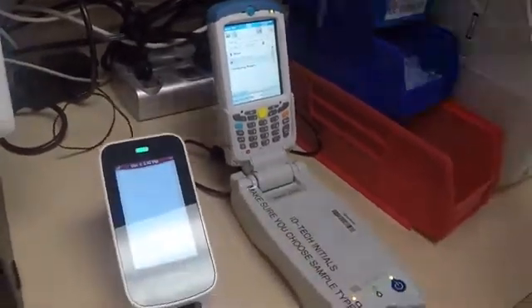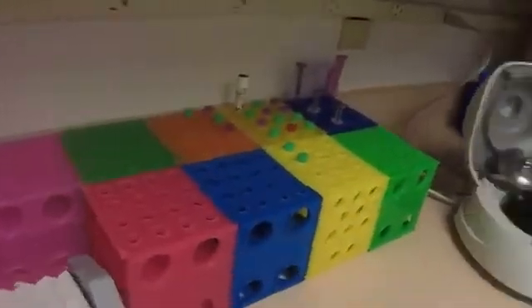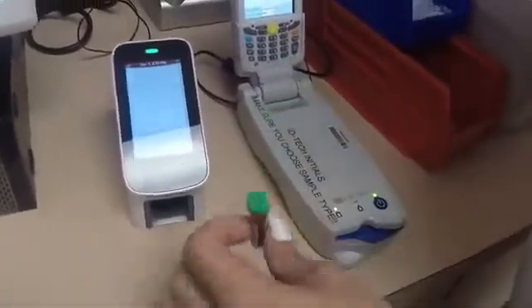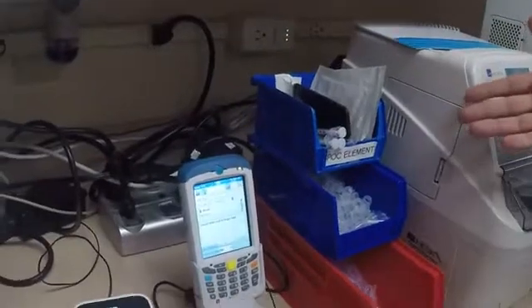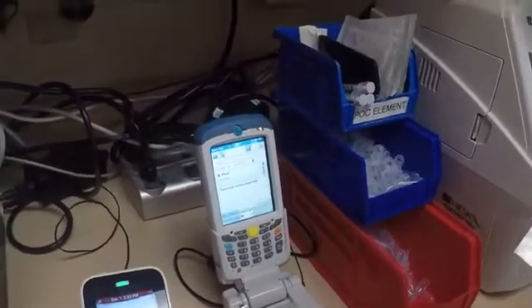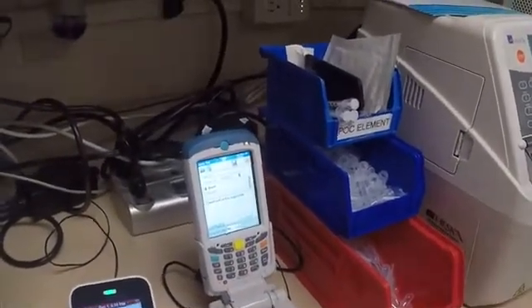Your samples are going to be heparinized unless it's an arterial sample. So anything venous that you're running on here, you're going to put into your green top tube and you're not going to spin it down. Test cartridges are kept over here — they're never kept in the refrigerator. Extras should be in backup Cubex.